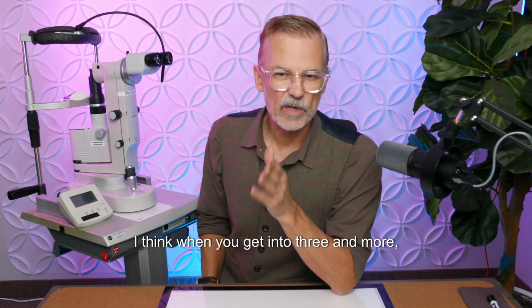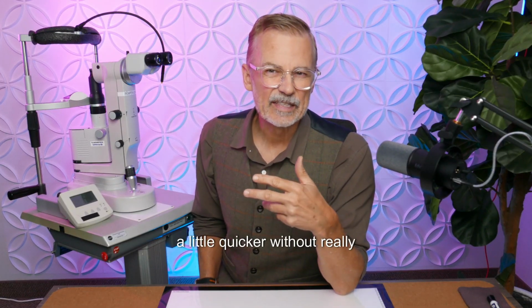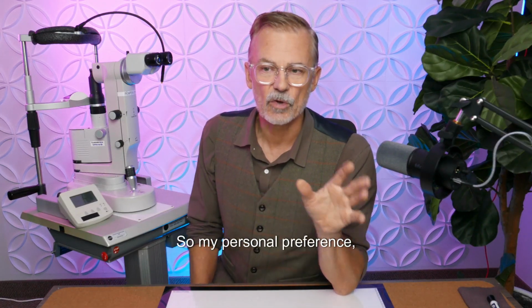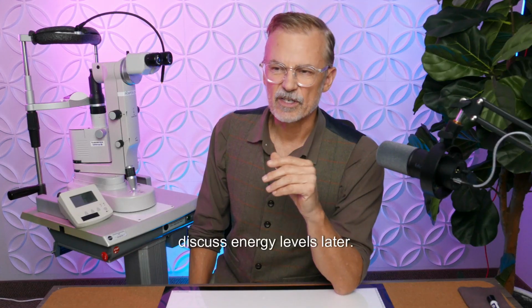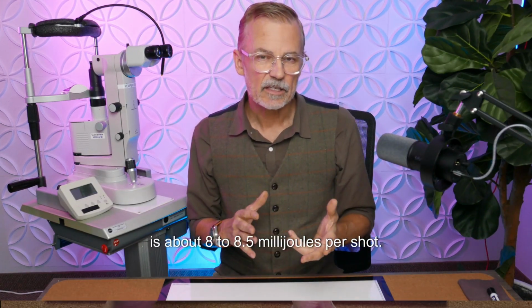I think when you get into 3 and more, you're just running up the numbers a little quicker without really delivering effectively more energy. So my personal preference, though you choose whatever you're comfortable with, is 2 bursts per shot. I'll discuss energy levels later. My personal professional preference is about 8 to 8.5 millijoules per shot. That's what the laser is sending out.